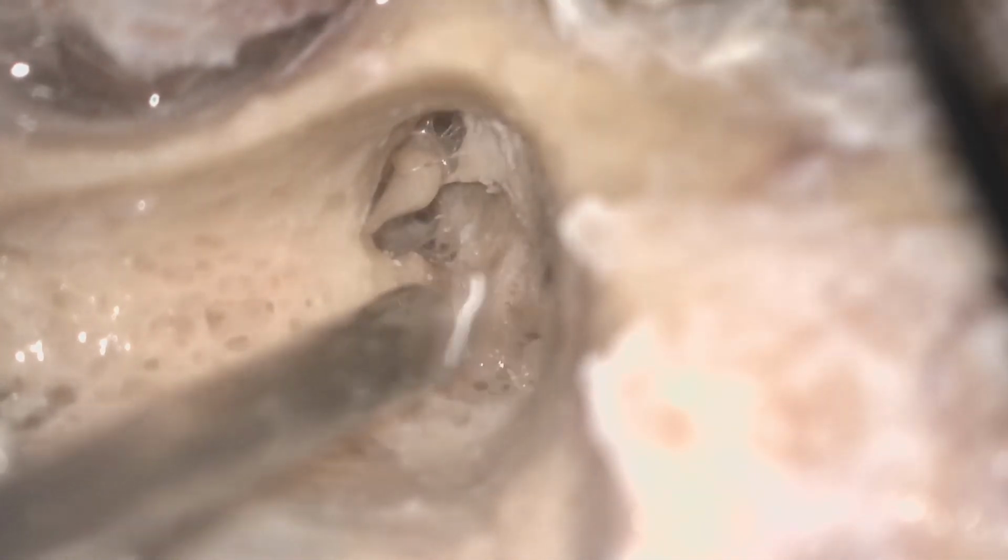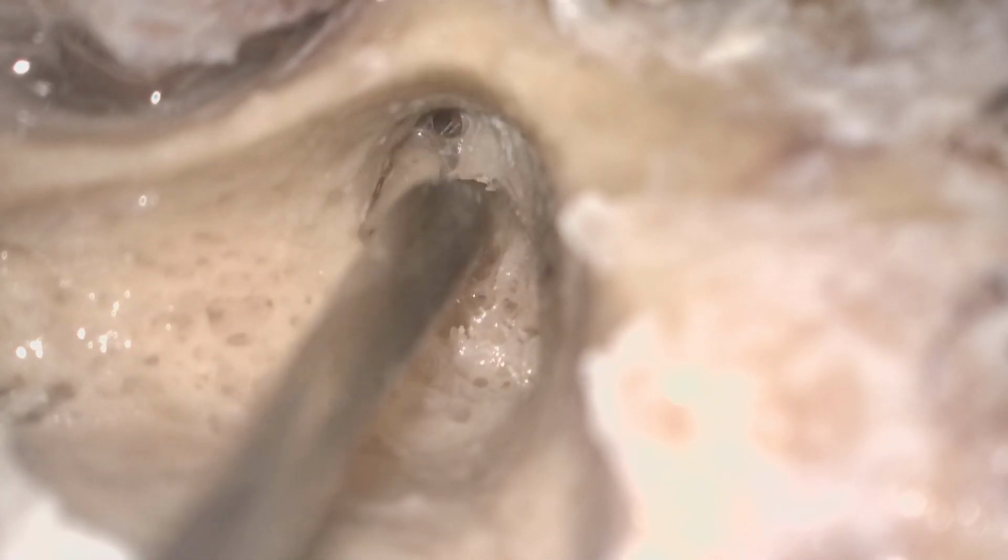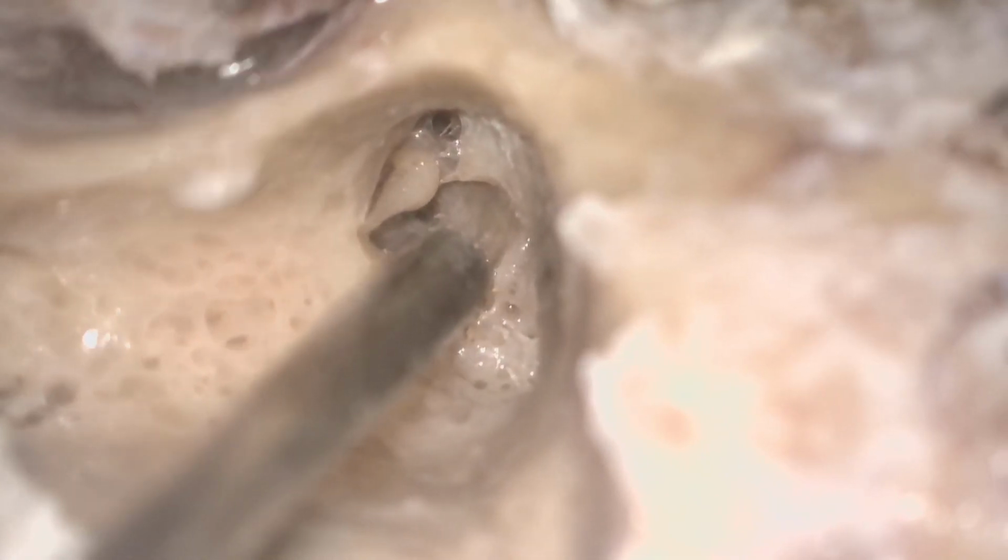And in the majority of cases when... Hello? Yes. Hello sir, can you please show the cog? Yes, wait for some time. We just have to go anterior to the malleus by drilling some bone here, then we will reach the cog. Okay.